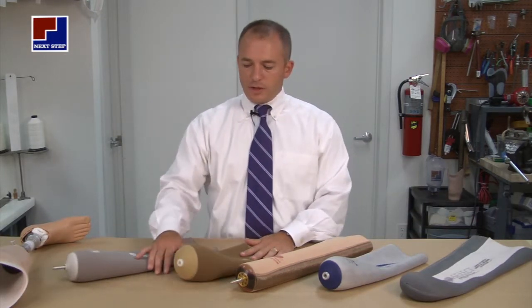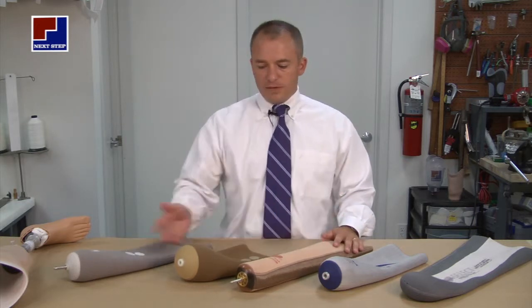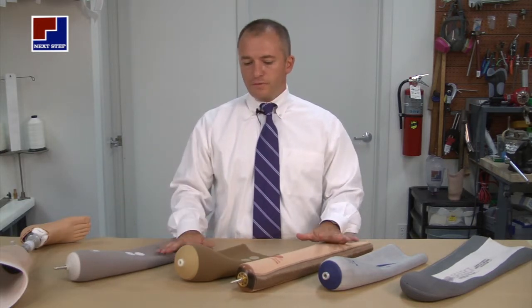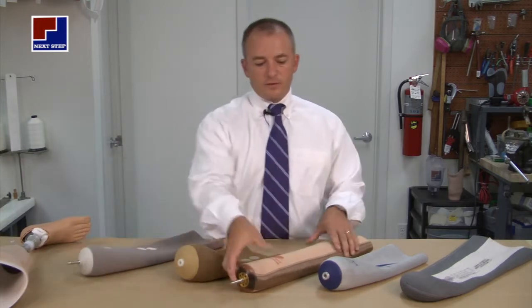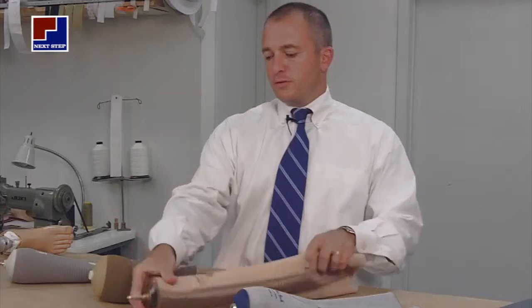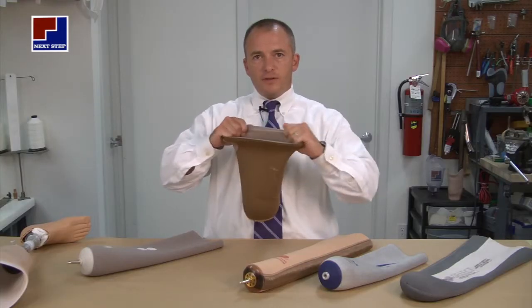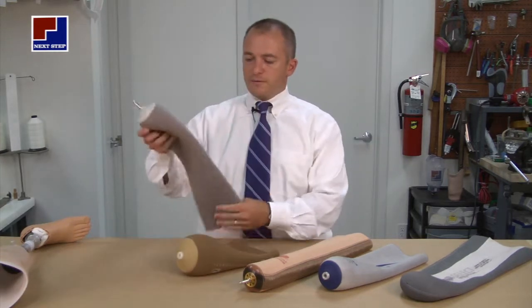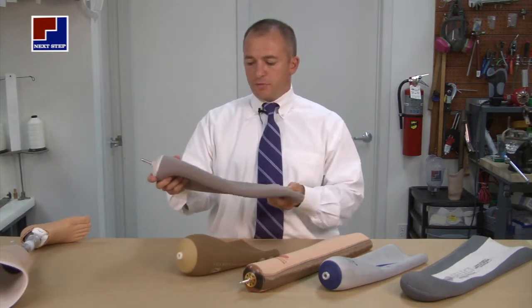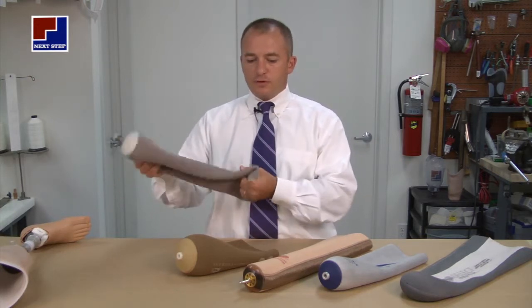In addition to all these gel liners, there are five main categories, with many different manufacturers for all different reasons. Some have a lot of stretch, some have very little stretch. Some are designed for low-activity amputees that need a lot of stretch. Others are designed for higher-impact sports, such as golf and running, to help give a little extra stability.